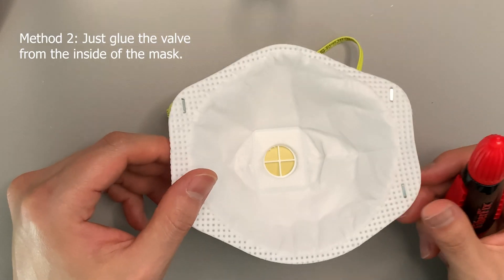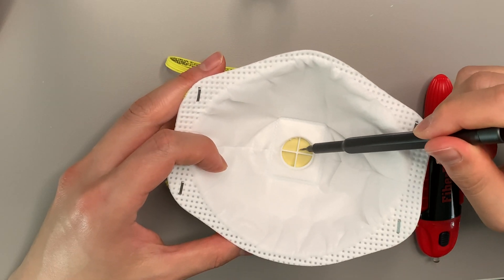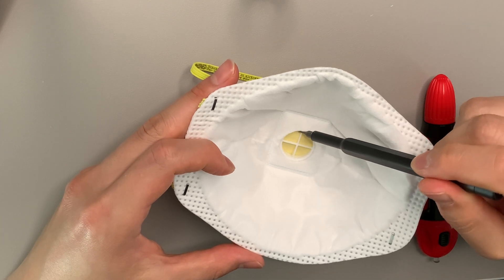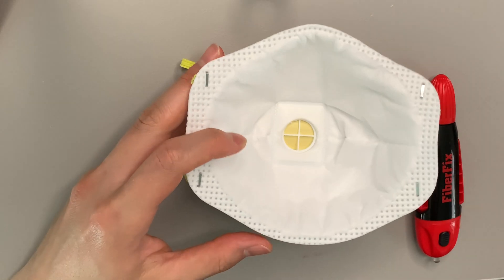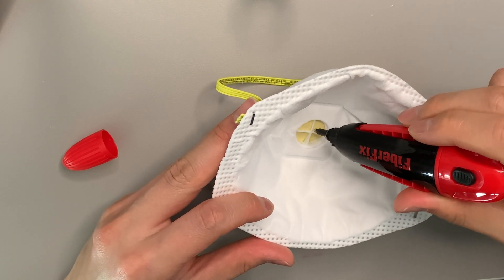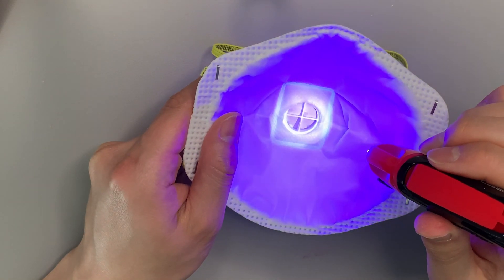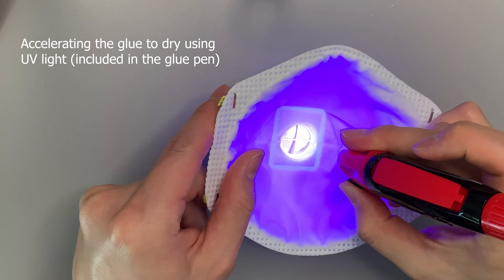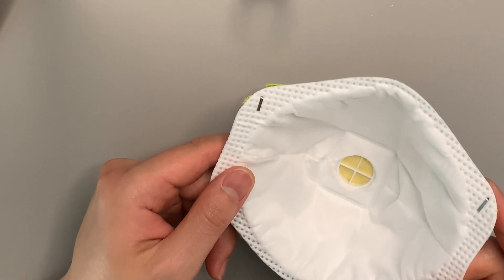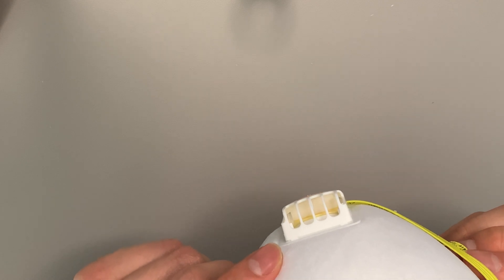The most simple and straightforward method is to glue the valve directly to the center. I'll put the glue right here so it can spread out across the seams, and also put a couple of drops on the bottom, because the top part is relatively secure but the bottom is the loose part. Okay, let's do it. It's dry now, and if you put it on — it's not moving at all.